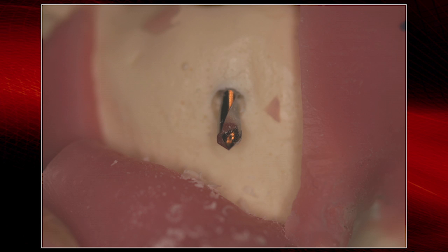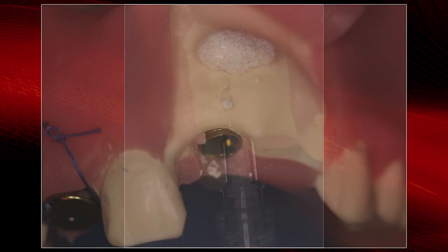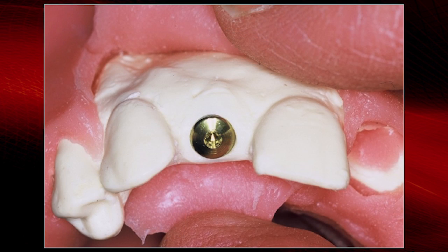So you can take and hydrate with saline whatever bone material you like to use, get it into a slurry mix, not compacted but very loose, and put it in the osteotomy. As you place the implant, it forces it through the opening and seals it because you have the periosteum and the tissue on the bone. So there again, you can see ideal placement, closer to the palatal bone and more bone to the facial.